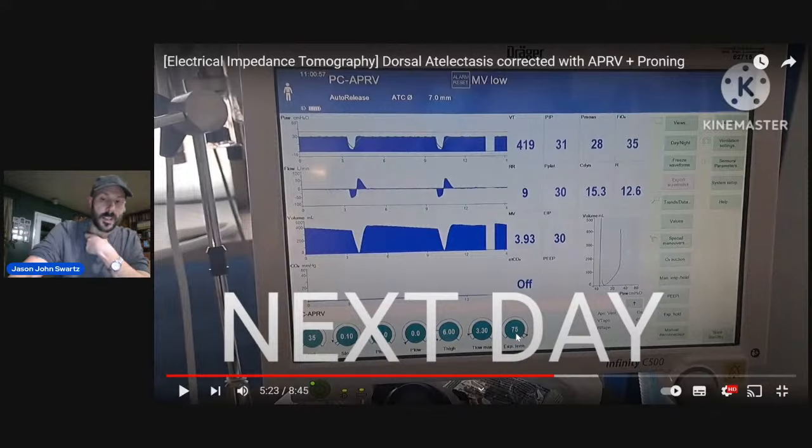The 75% falls very often on optimal PEEP. I've noticed that's one thing. So if I do an optimal PEEP and let's say the plateau is 25 and I set my P high at 25, I set my auto release at 75, it'll fall almost exactly on it, or one higher, one lower about.